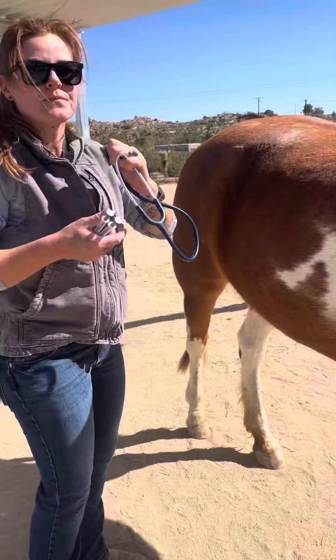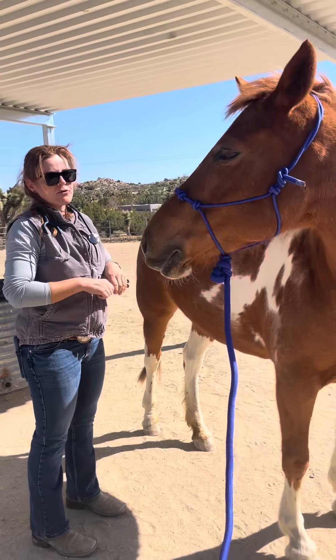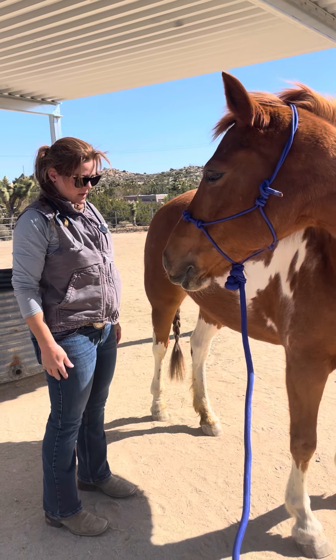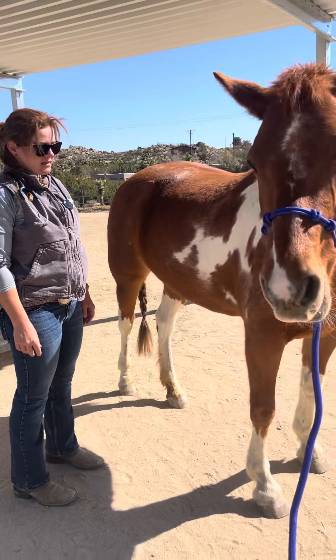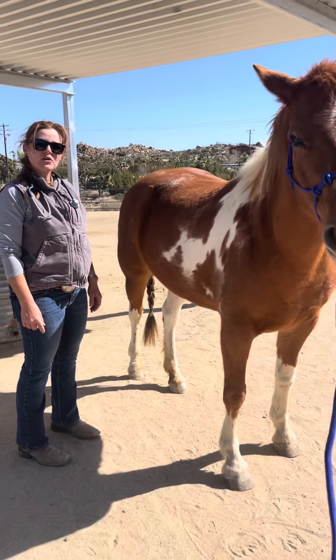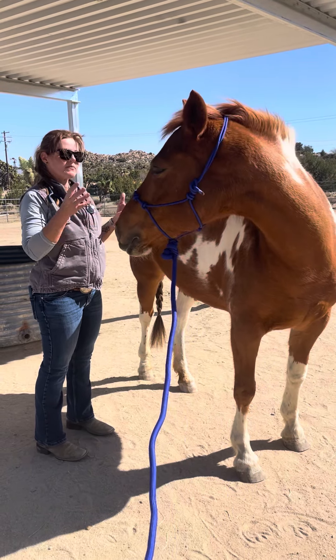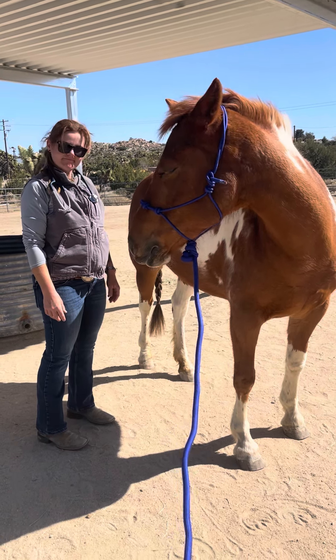And what does it sound like when they do have sand? Sand sounds like you're listening through a seashell — it's an oceanic sound. The more sand there is, the easier it is to find that pocket. If there's not as big of a sand burden you might have to wait, linger, and let the gut movement stir up that sand pocket, and then you'll hear it, but it sounds like the ocean.